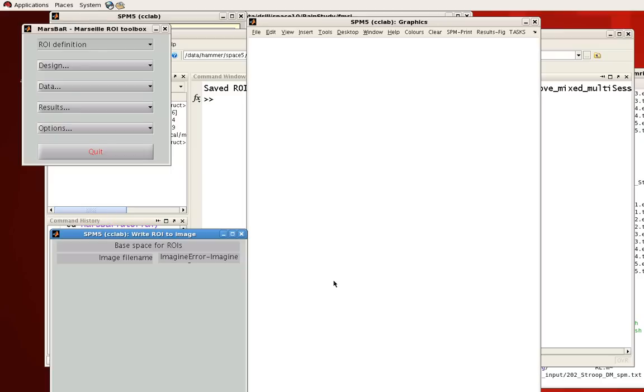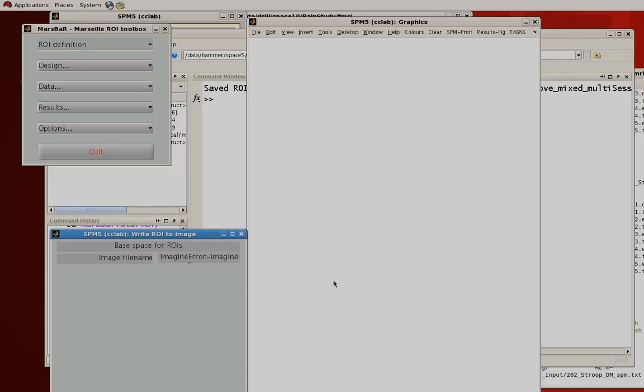So now we've looked at using MarsBar to create ROIs based on coordinates and based on analyses from other contrasts or other analyses. Now that we have these regions of interest, in the next tutorial we can use tools, both within MarsBar and from the command line, to extract beta weights and other information from that cluster of voxels.